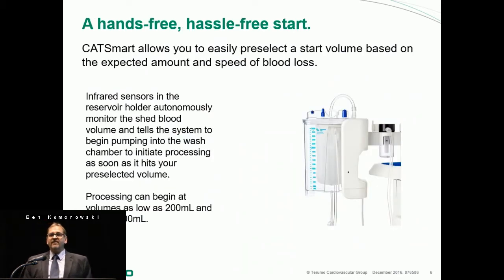They have also added an auto-start function. The auto-start is an infrared design, and you can set it to automatically start processing at a level of between 200 milliliters and 3,000 milliliters.